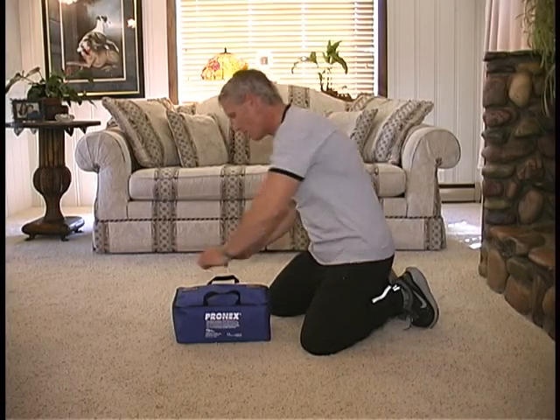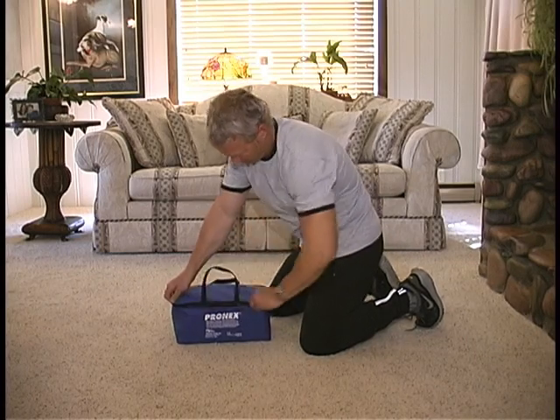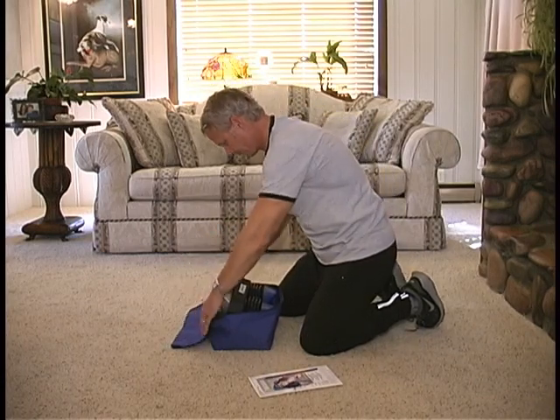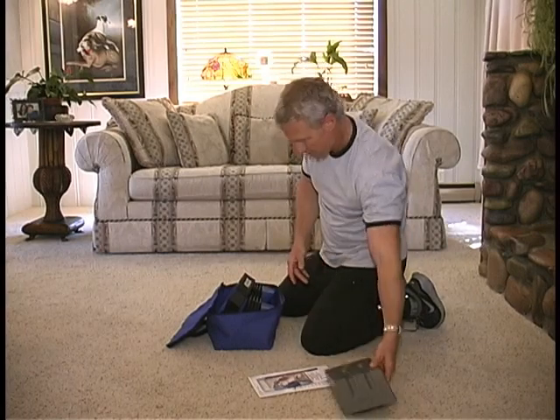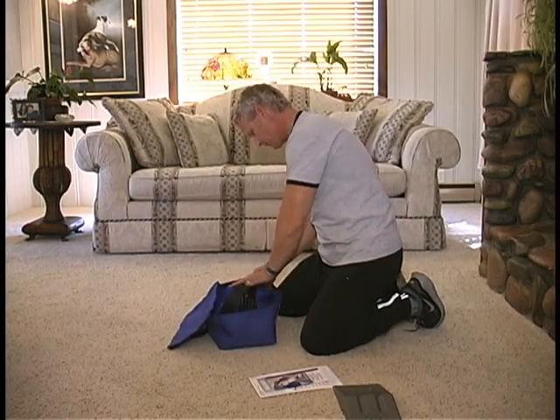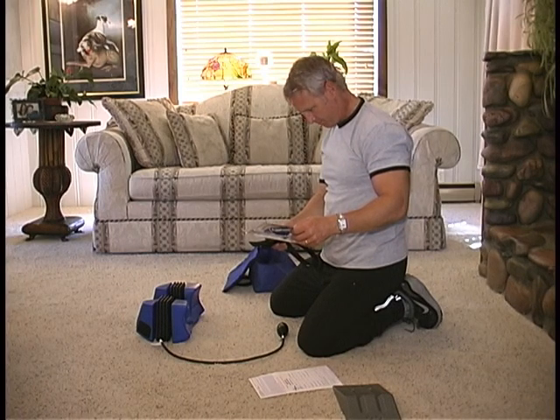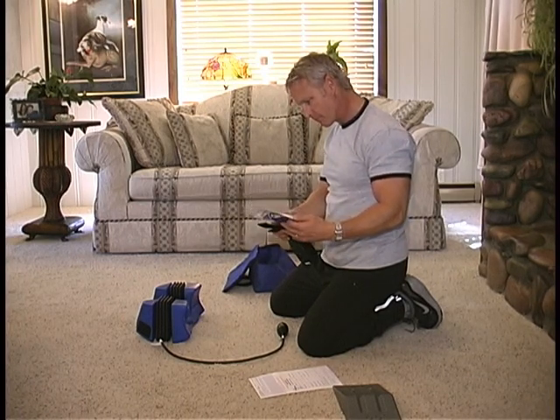On a flat floor or stable surface, unzip and remove PRONEX written instructions from the travel bag. Remove the gray flexion wedge and slide it to one side. Now remove and place PRONEX on the floor and remove the head strap.